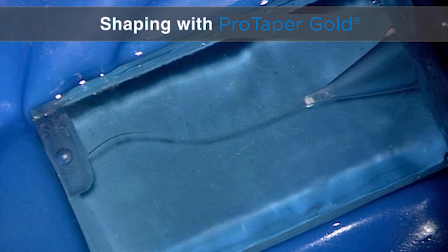Many instructors like to show extracted teeth, or they like to show a 3D printed model, and those are really good exercises for colleagues around the world to utilize in workshop participation. But this is a very good challenge because it is a multi-planar canal. Plastic is harder than dentin to work in — plastic is soft, so because it's a little softer than the Brinell hardness of dentin, it's much easier to ledge or block a canal. So we're going to have to put all the steps together very precisely and follow them exactly so that we can guide this canal shaping procedure right to a successful conclusion.